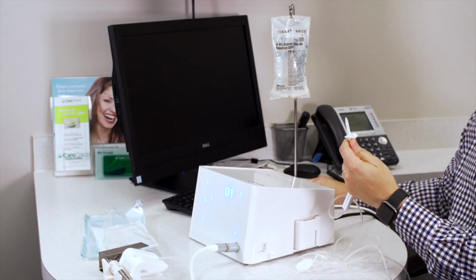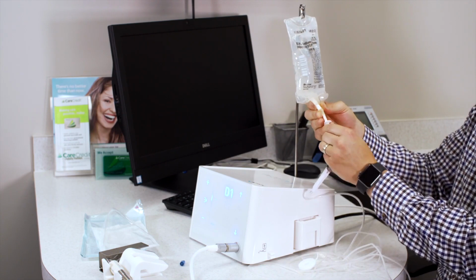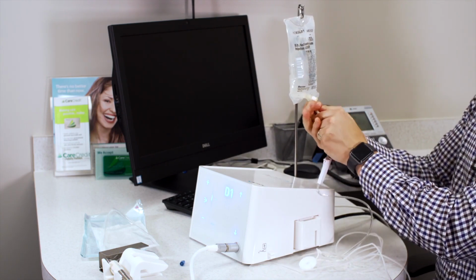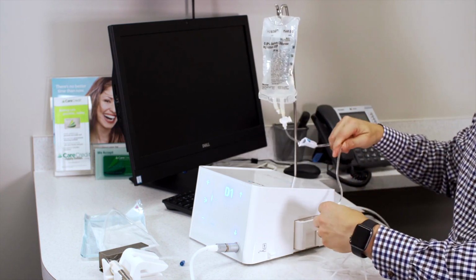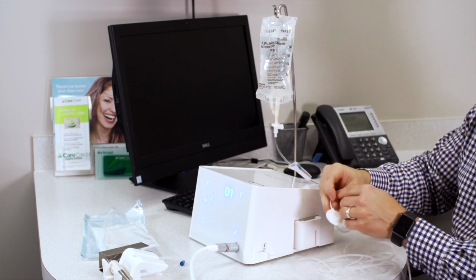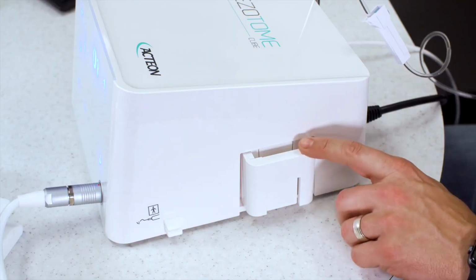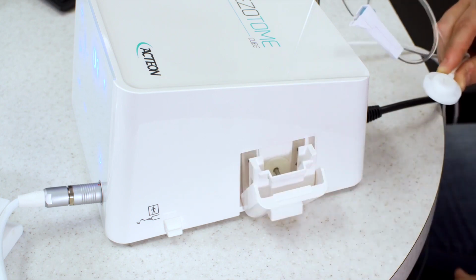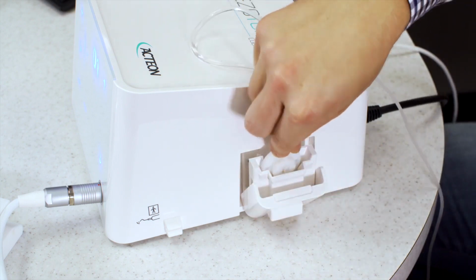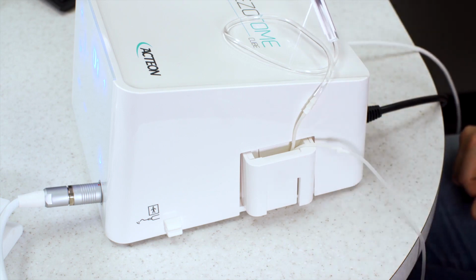It's got your little needle tip that goes in your saline, just like your normal saline bag here. But then it has a special type of adapter, so it's not the same tubing as you would use for your implant motor. Here's the motor hookup for the tubing. This just slides open and closed, and then you have this little round wheel. It slides in and engages like such. Very easy to plug in and plug out.